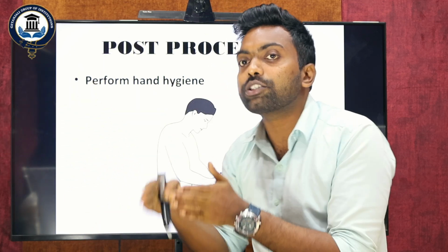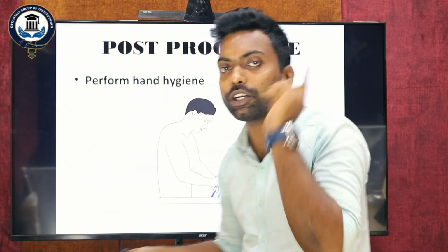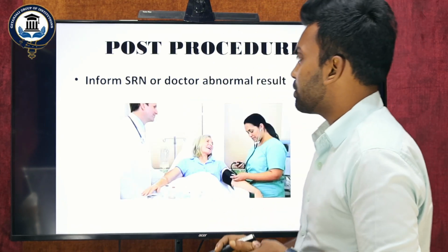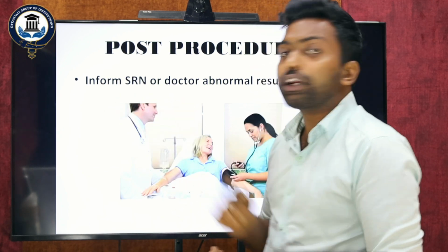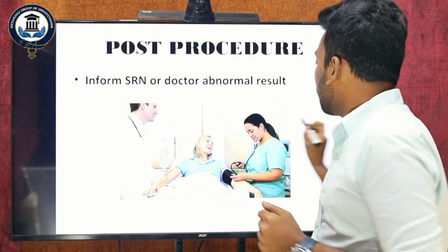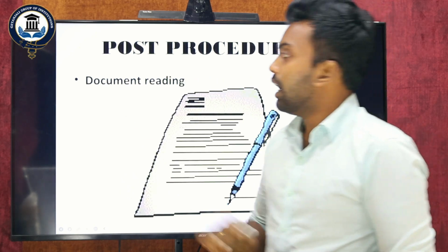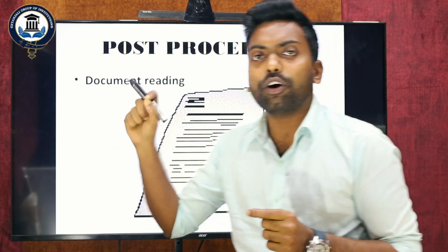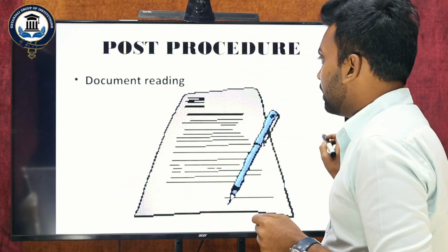In order to break the chain of infection, you must go for post hand washing also. Later, inform the senior sister or doctor of the reading you got. Then you must go for documentation. Documentation is very important once your procedure is completed. Whatever procedure you complete, you must note it down on the case sheet.